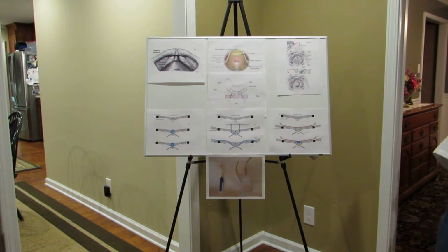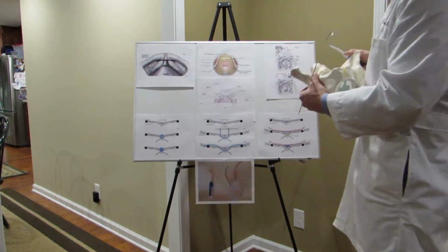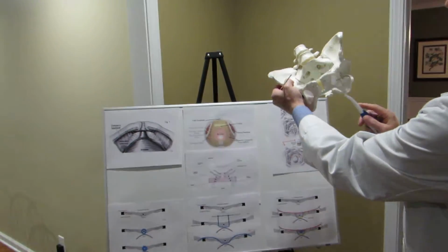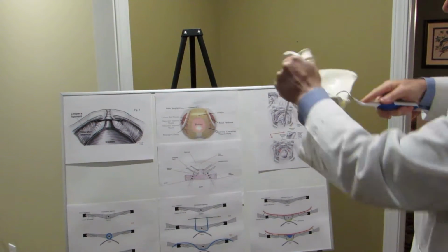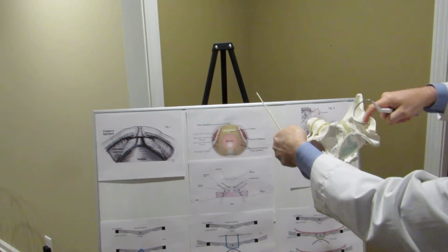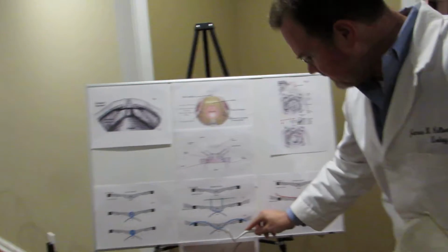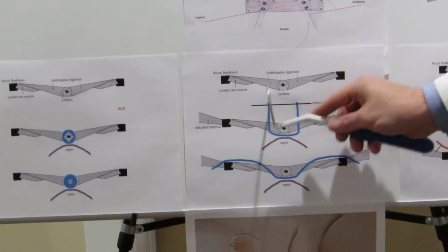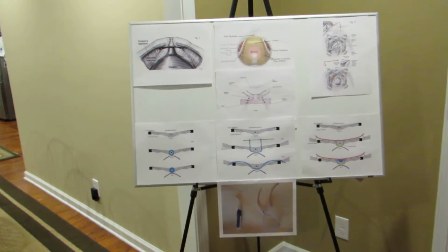An example of this is the transobturator, much more commonly done nowadays. It perforates right through the obturator canal, comes right behind the pubic bone, and out through this area right here. You do the same on the other side, and your sling would travel through here. That's a transobturator. There's very little space here, but that small mesh sling could fit under here and perforate through these fascial planes in order to anchor it in place and to prevent hypermobility.